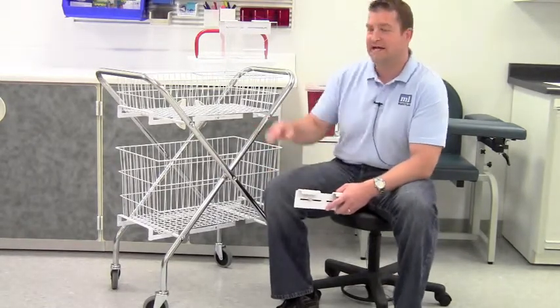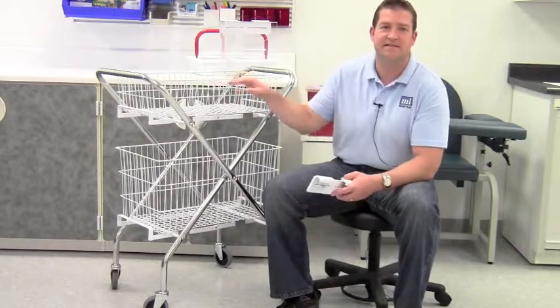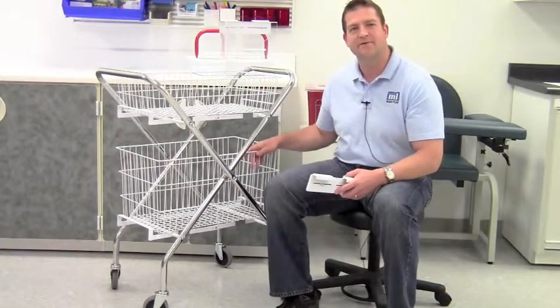The 6 inch deep basket on top is where you keep the supplies that you need for your rounds, while the 12 inch deep basket on the bottom holds extra supplies so you can restock your tray without having to go back to the supply room.